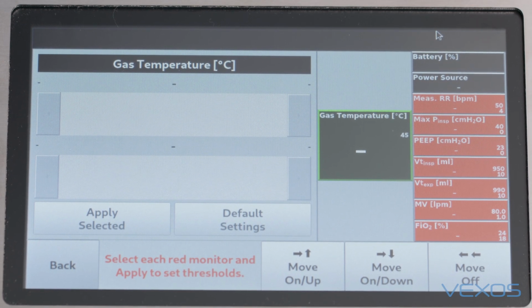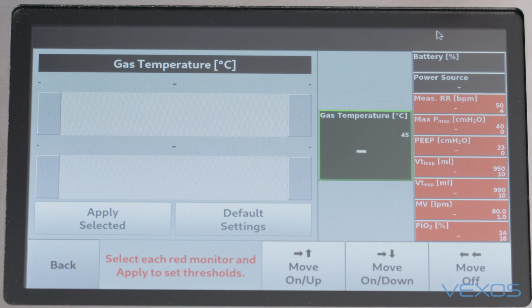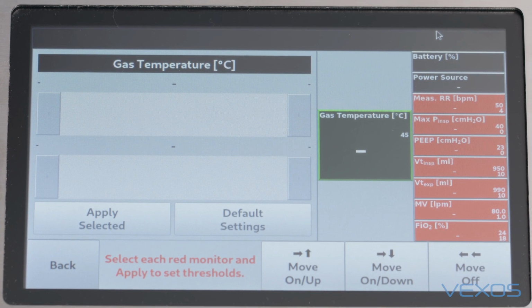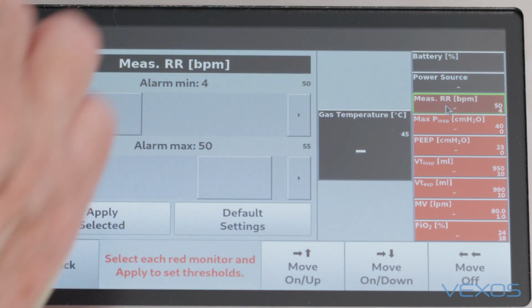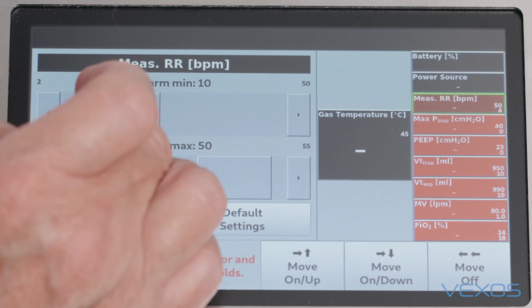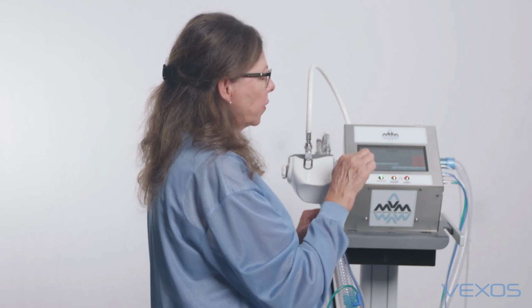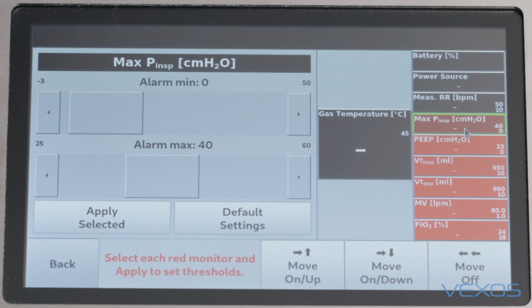The top one is not an alarm, it's just the battery percent, and the second one is the power source. It's not an alarm. But you do have measured respiratory rate, maximum inspiratory pressure, PEEP, inspiratory tidal volume, expiratory tidal volume, minute volume, and FiO2 or oxygen level. By touching the red tab, it brings me up to the rate alarm. I can choose default, or I can change the settings by simply pulling this tab across, and that changes the settings. If I like those settings, I will apply selected. And if we look back into my alarm tab over here, the new alarm settings are shown.